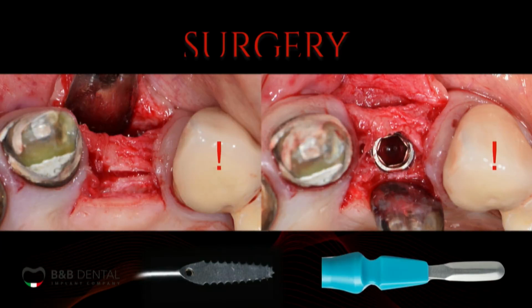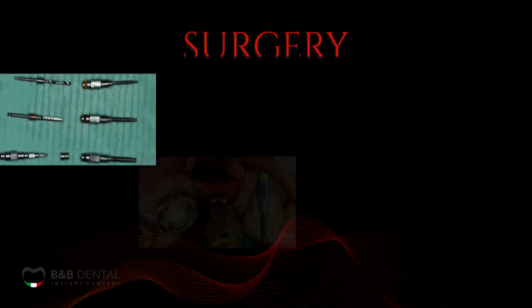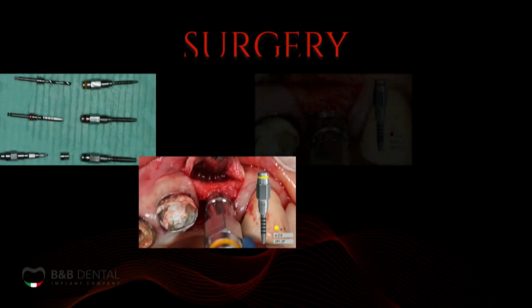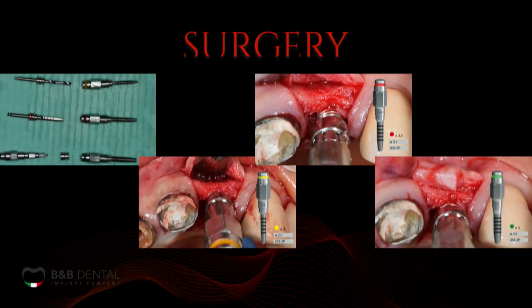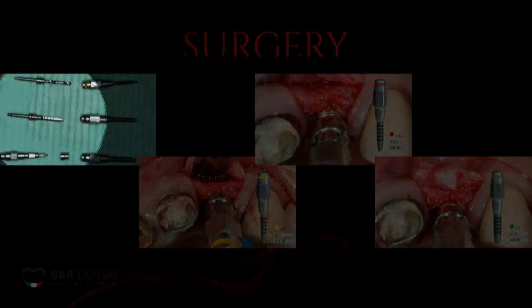Then I go forward with the screw type expanders. Actually, we don't need a lot of instruments to perform this kind of surgery. Here is an example of the instruments that I use for this case.